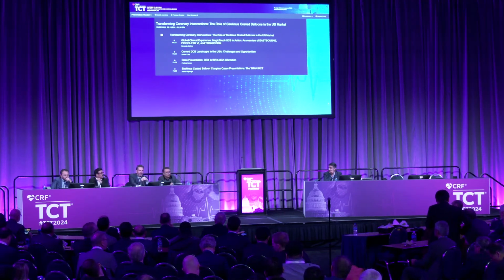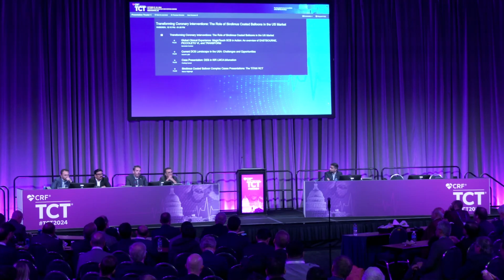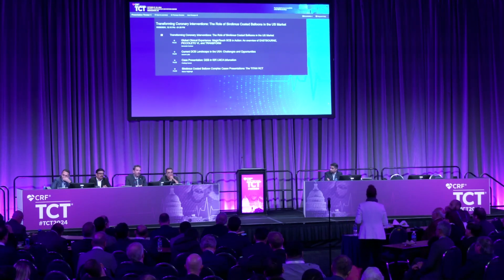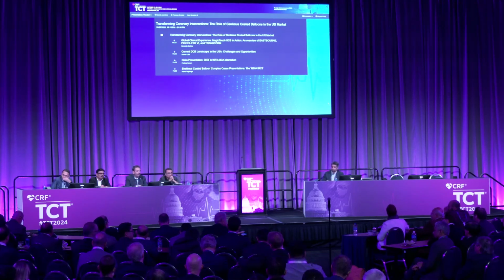Yeah, this is a very important study presented at the ESC a few months ago and published in The Lancet. It's a randomized clinical trial of a paclitaxel-coated balloon, the Swide DCB, compared to the latest generation drug-eluting stent in an all-comer population with any vessel size. The primary endpoint of non-inferiority was not met at 1 year in terms of clinical performance by this paclitaxel-coated balloon, because there was an improvement in the DES. Then they went through an analysis according to vessel size, which will be presented during TCT later, showing that in the small vessel disease setting below 3.0, there is no significant difference between the two devices, whereas in the largest setting there are very few events in the DES and more in the DCB group.